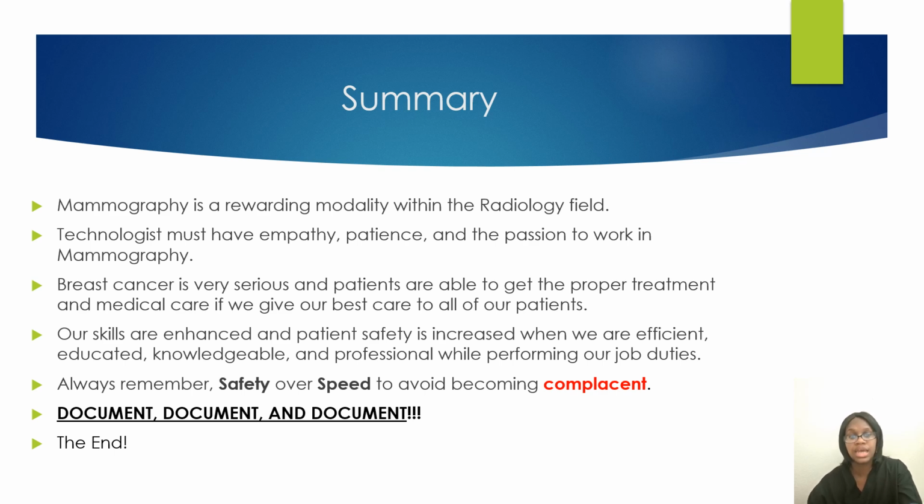Our skills are enhanced and patient safety is increased whenever we are efficient, educated, knowledgeable, and professional whenever we are performing our mammography duties. Always remember, this is very important, safety over speed. Do not become complacent at your job. You will make mistakes. You will image the wrong patient. So document, document, document. Always document. Do not skip this step. It does not take long to document.